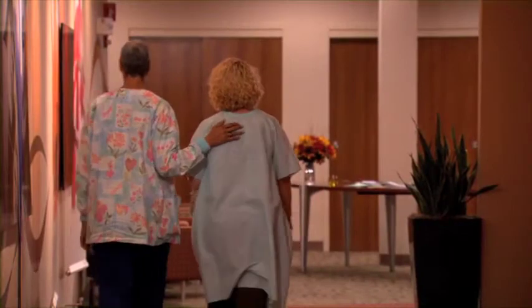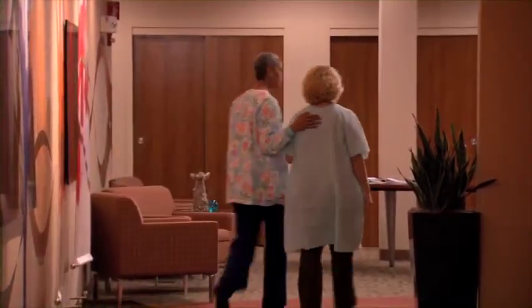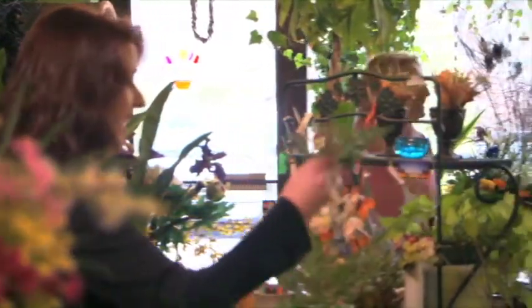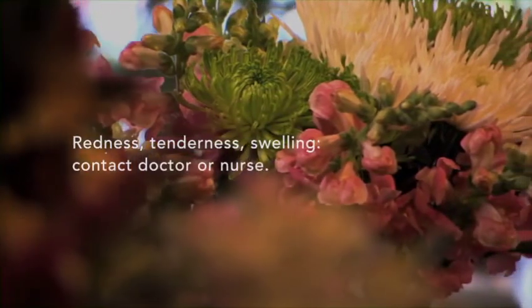The technologist will apply pressure for several minutes and bandage the incision in your skin. Now your technologist will bring you for a post-biopsy mammogram. Once that's done, you can go home. Most women are able to get right back to their normal lives the same day. It's normal to feel some discomfort. There's a tiny nick in your skin that will heal in a few days. Your physician will provide post-procedure instructions.